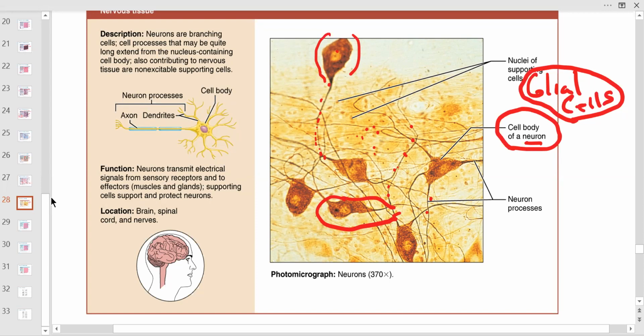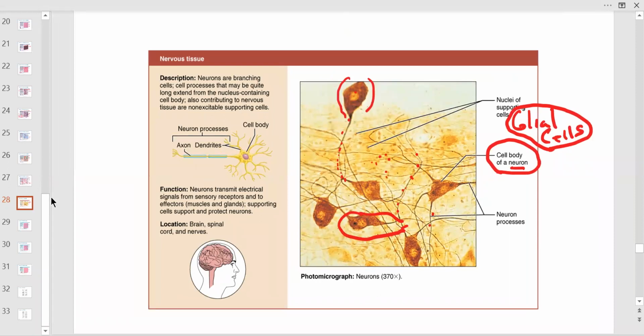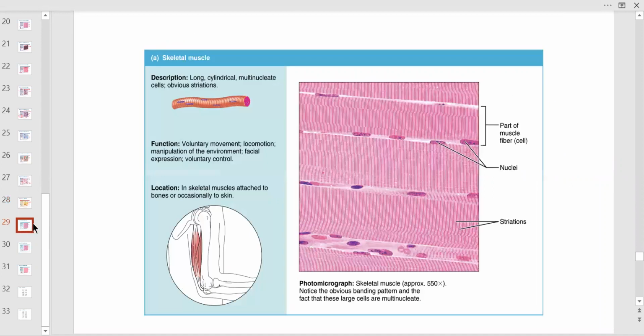Yeah. So the matrix, and again, this is not connective tissue. Let me start by saying that. This is not connective tissue. Now we're into nervous tissue, right? Sorry, I jumped into another tissue without assuming that you knew that. But this is nervous tissue now. So we're not looking for sparse cells in a matrix here. This is specific cells. Bone is connective tissue. Adipose is connective tissue, but now we're in nervous tissue. And I think that's the only type of picture you need to know.